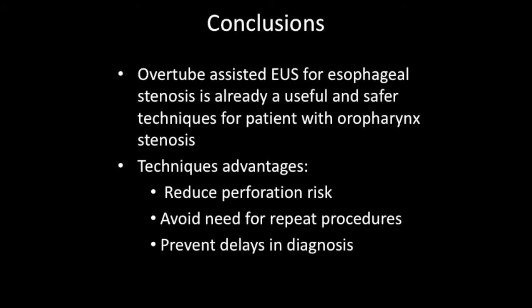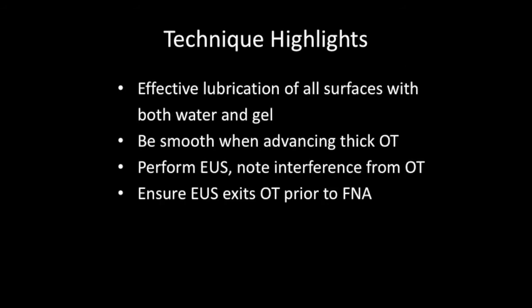This demonstrates the successful use of an overtube to assist safe passage of larger, difficult-to-manipulate endoscopes without forward view through esophageal stenosis in order to obtain a diagnosis. This additional step reduces the need for repeating procedures, delays in diagnosis, or inferior sampling techniques such as CT-guided biopsies.